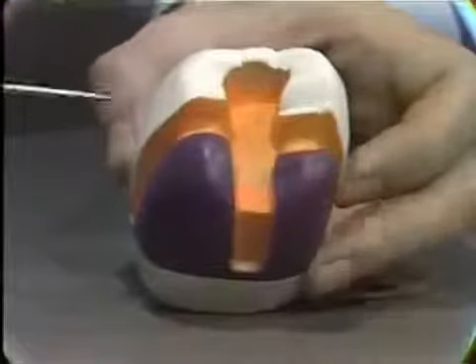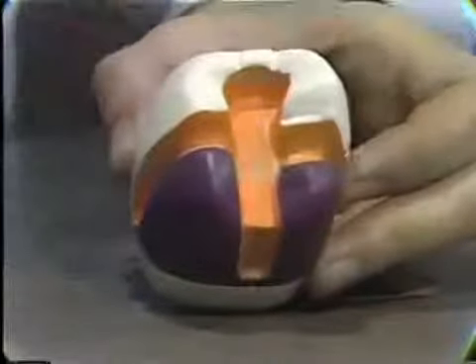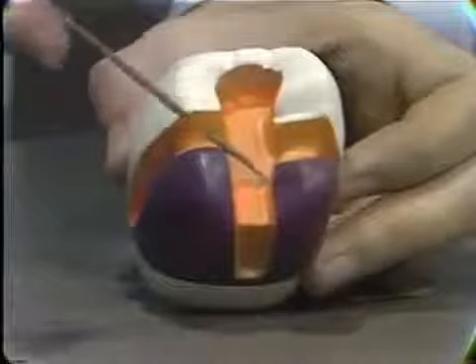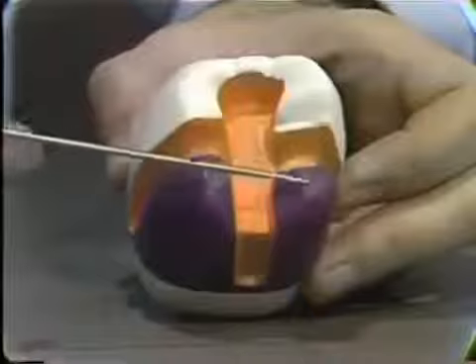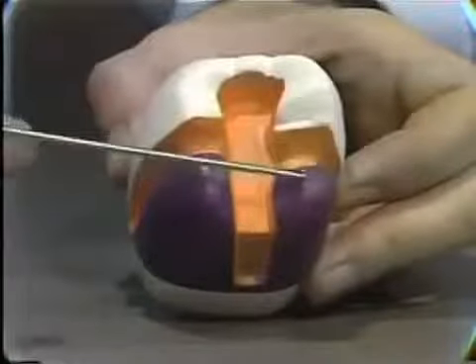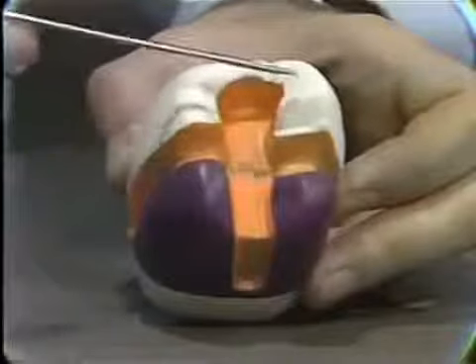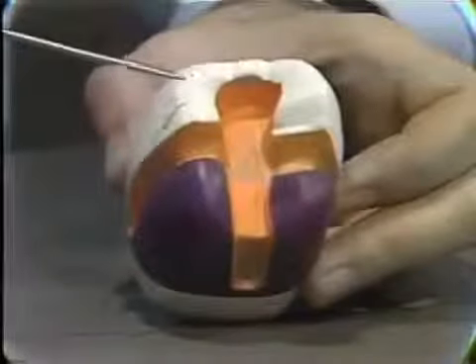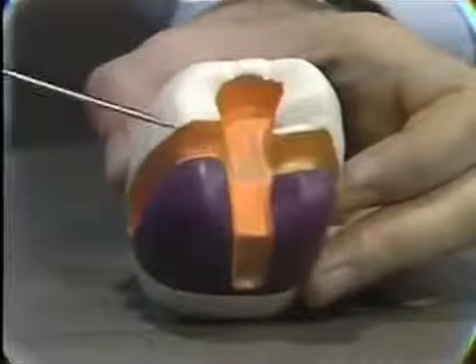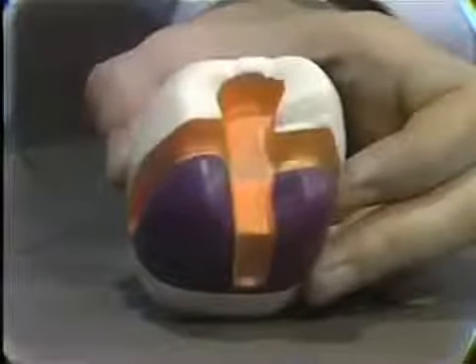And so the three-quarter crown gains its retention from grooves which this time are on the buccal and on the lingual surface of the tooth here. It has an occlusal keyway running through, as you see here, rather like a class 1 inlay. You can see that the mesial cusps on the buccal and the lingual are covered and protected by the restoration. However, in this particular preparation, the distal cusps on the lingual and the buccal are not protected. They can be if the situation requires it. The preparation can be extended to give protection over those distal cusps also.